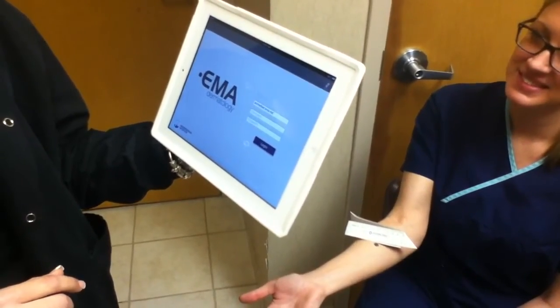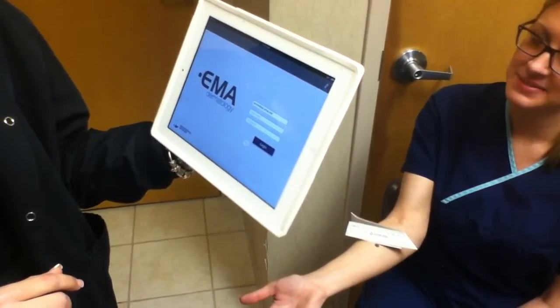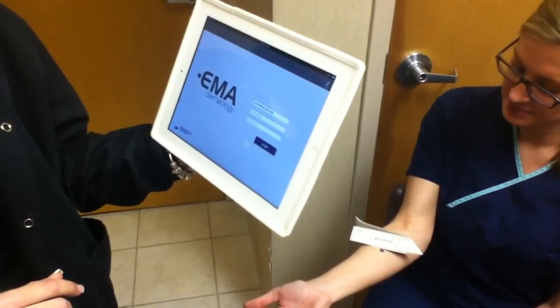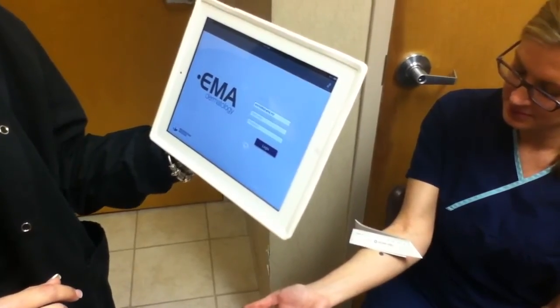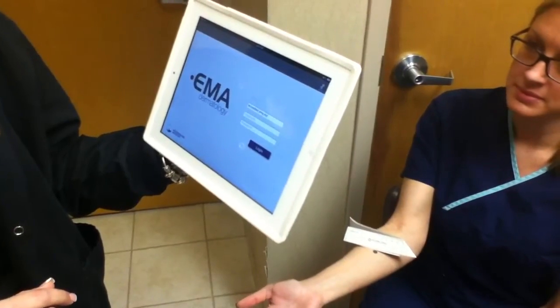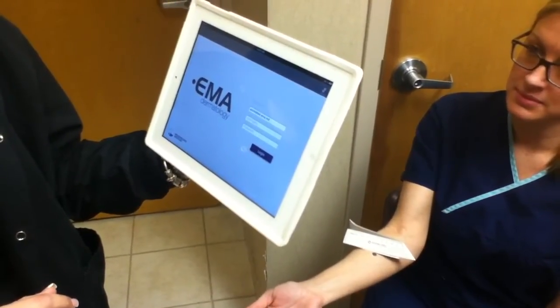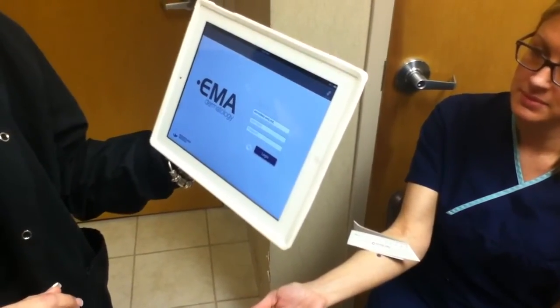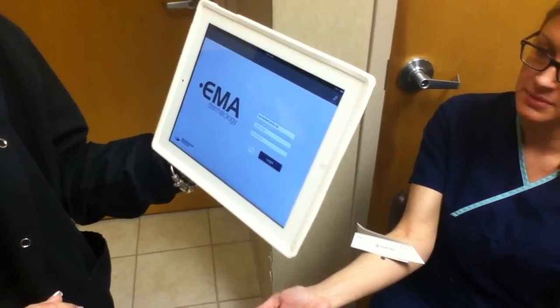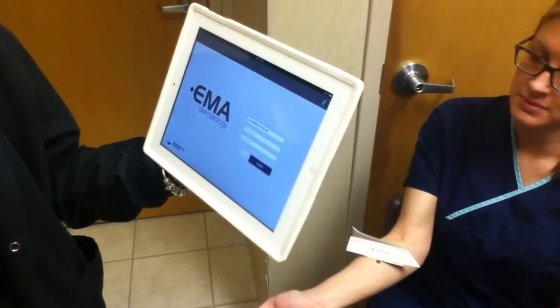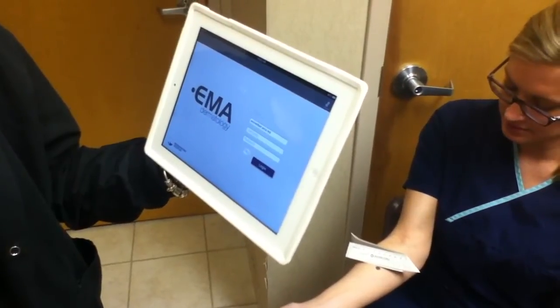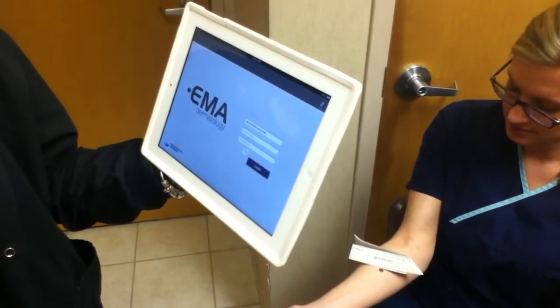Good morning. Today we're going to demonstrate the proper use of EMMA and the iPad to take a picture of a patient's lesion so that it can be attached to their record, in addition to the triangulation coordinates, so that future reference will be able to more accurately identify the site after the biopsy has healed.